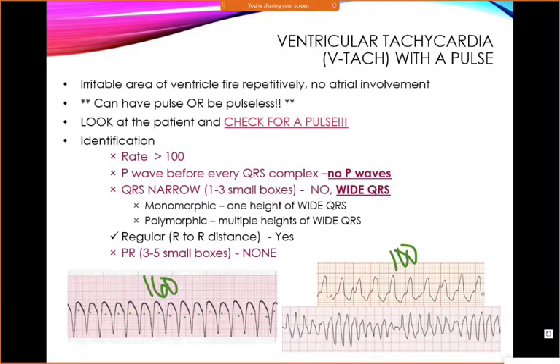So check your patient with any of the VTACs. You will recognize ventricular rhythms because they're wide and weird looking. Anything wide and weird you throw into the ventricular column. All of the atrial rhythms had that narrow, normal QRS. You can throw it into atrial if it's narrow and normal rhythm, and you throw it in ventricle if it's got a wide QRS.